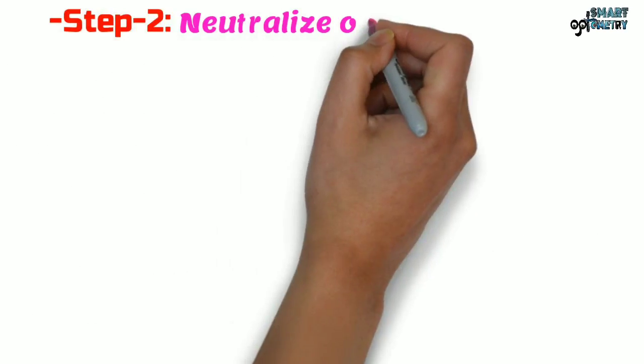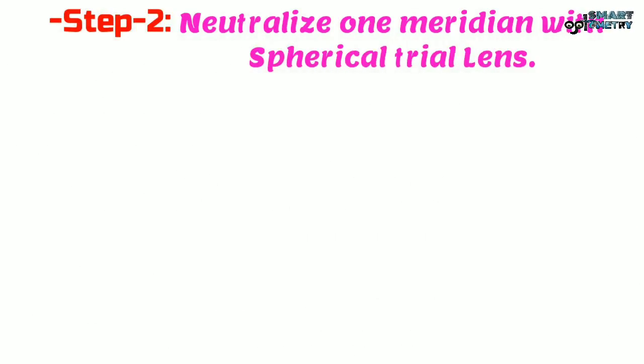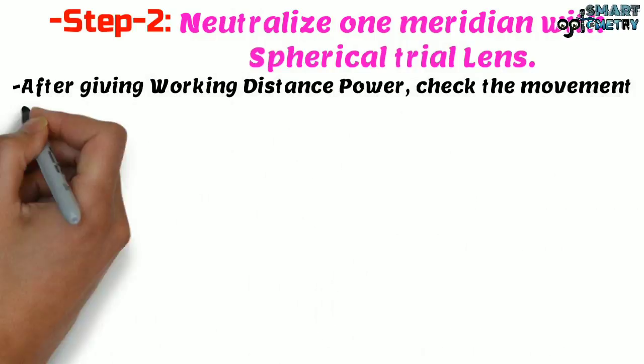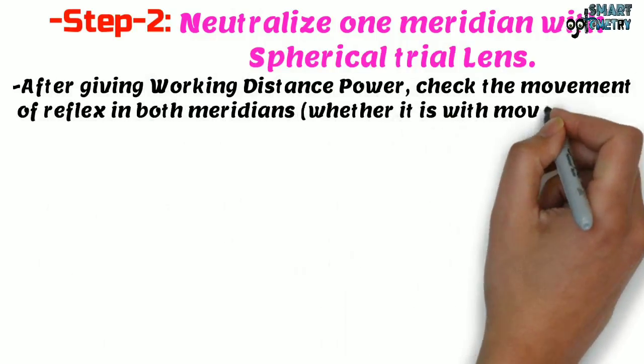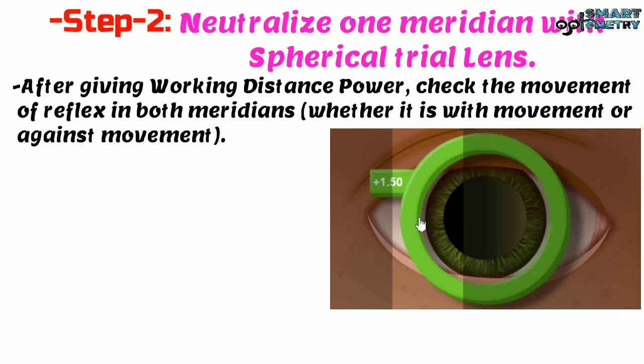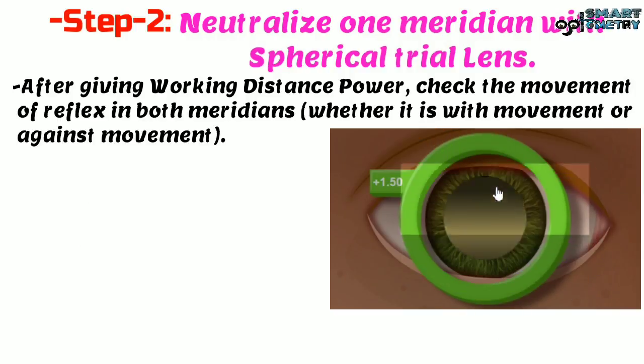Step 2: neutralize one meridian with a spherical trial lens. After giving the working distance power, check the movement of the reflex in both meridians — whether it is with movement or against movement. For this patient, after giving the working distance power, we can see that in both meridians the movement is against movement.